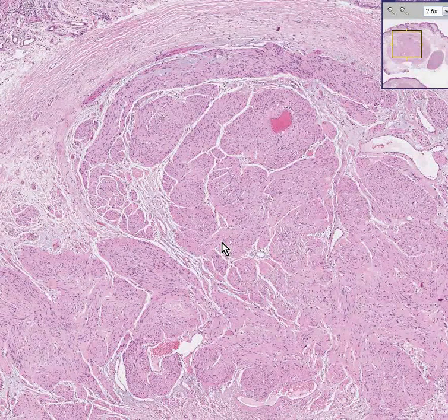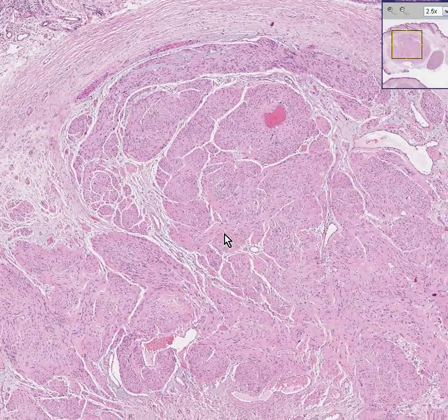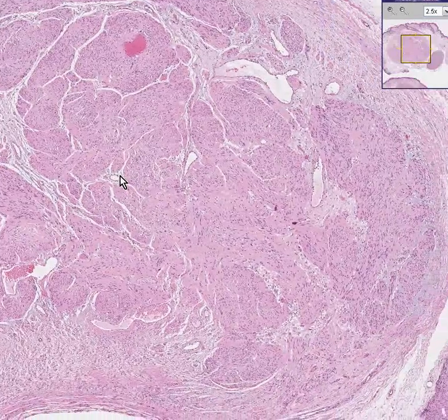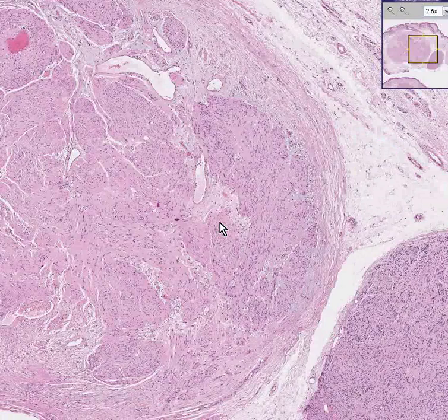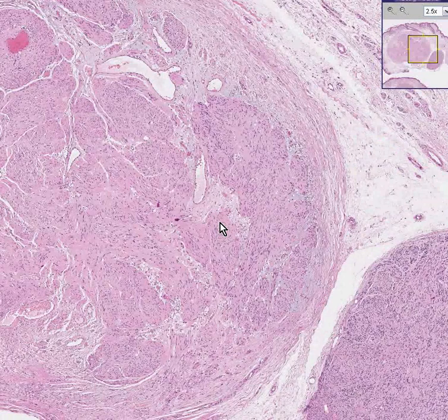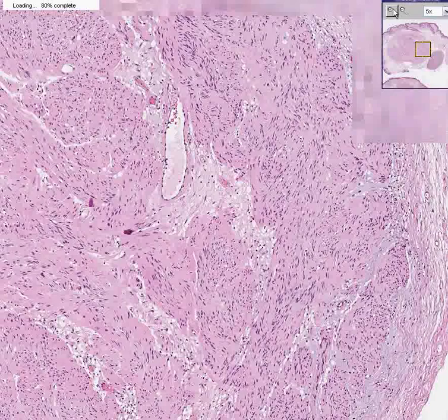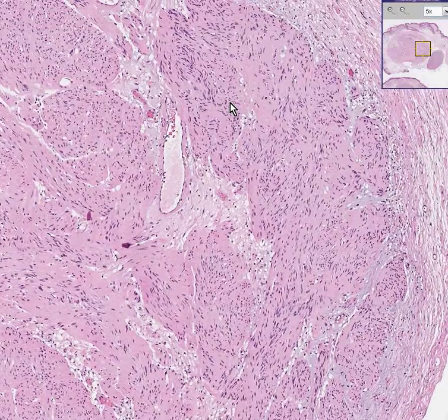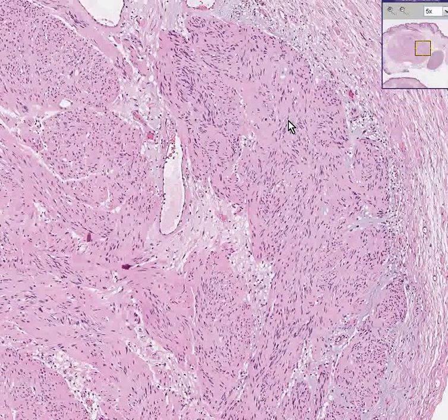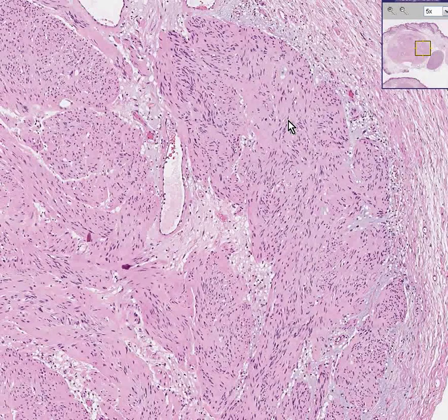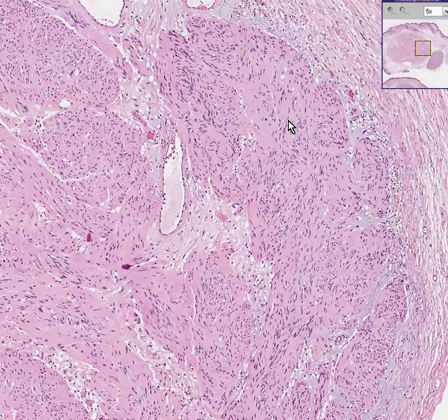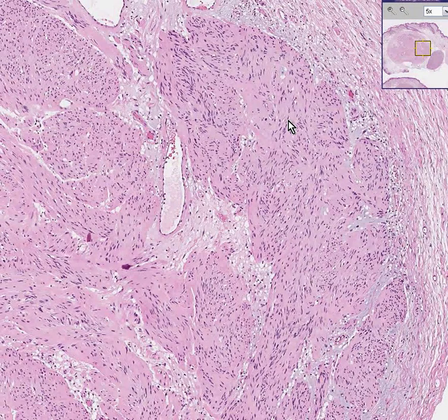This is the classical or garden variety type of tumor, almost always benign, of a peripheral nerve called Schwannomas. Schwannomas classically have two areas — they're called Antoni A and Antoni B.